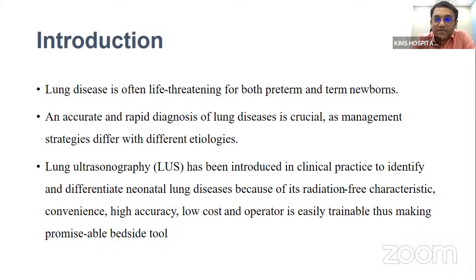However, there are certain problems with X-rays. We need a specific examination, we need a technician, and we need the film to get printed. By the time all these things happen, a delay can occur before we can diagnose the condition and treat the baby. So nowadays we can use lung ultrasonography as an adjuvant, or sometimes even replace the X-ray, for better management in the units. It's also helpful for differentiating different kinds of lung disease so that we can tailor-make our management.